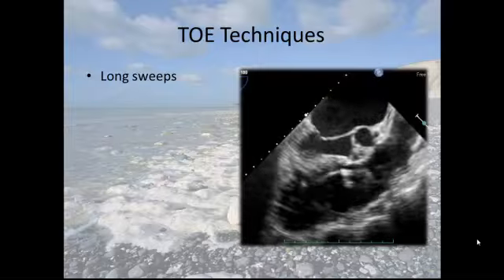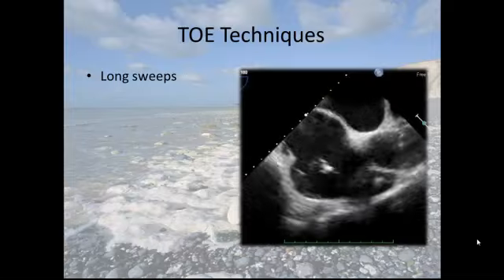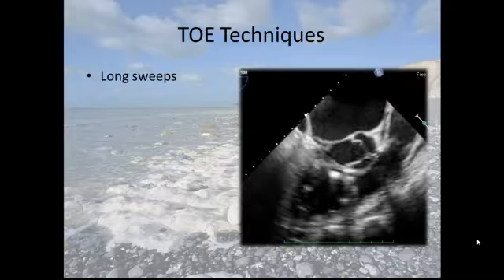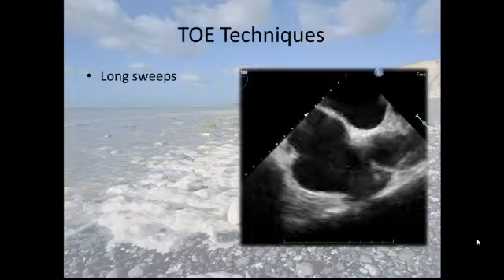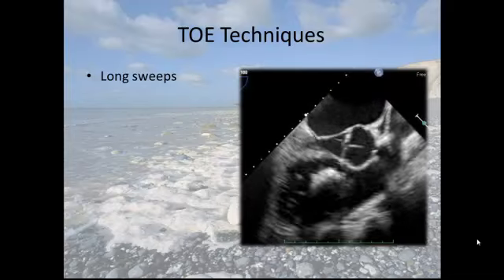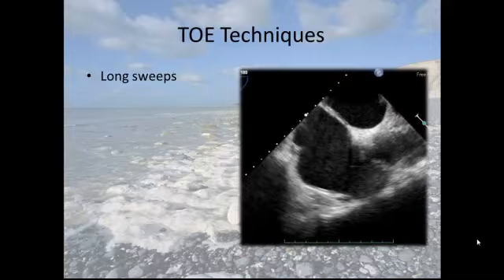So we're going to look at the superior vena cava here, and the lead comes in, and suddenly you can see a white blobby bit. Now this is your suspected vegetation here, and then as you come up the pulmonary outflow tract, you see something that looks most unhealthy. So using that strip gives you immediately a more rounded feeling of what's going on with the lead, but you do need other techniques, and here more modern techniques such as simultaneous biplane.